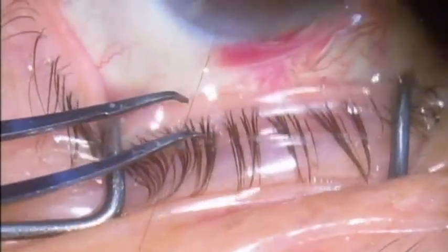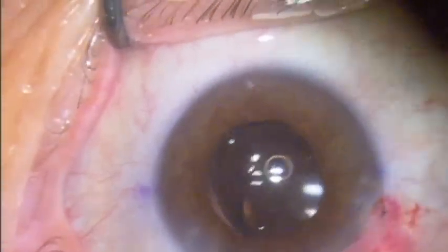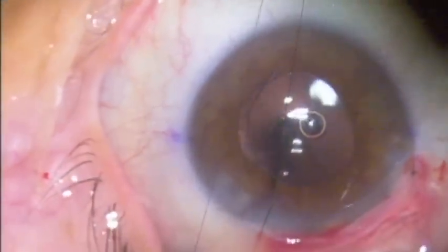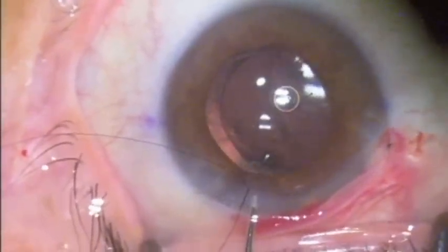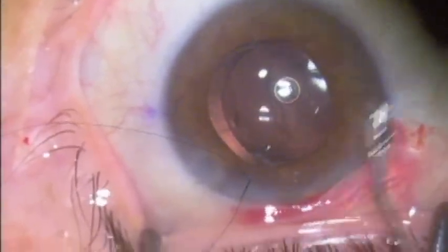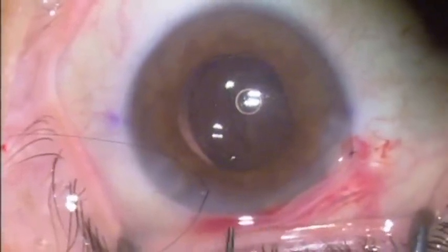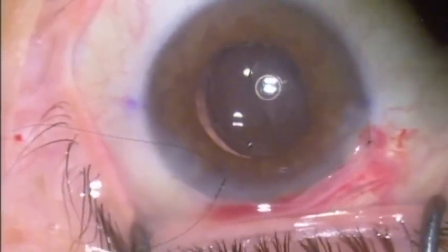First, I reopened the incision with a Sinski hook and then sutured it fairly tightly, adjusting the tension on the suture after refilling the anterior chamber with BSS. The suture's initial throw is made fairly tight. The anterior chamber is deepened with BSS to raise the pressure a little, and then the final throws are made after tightening to make sure this incision does not contribute to any flattening in this meridian.